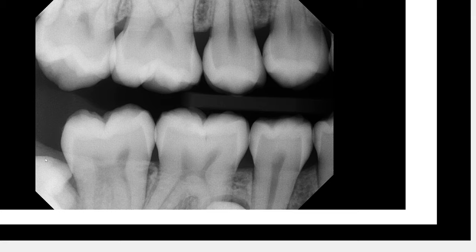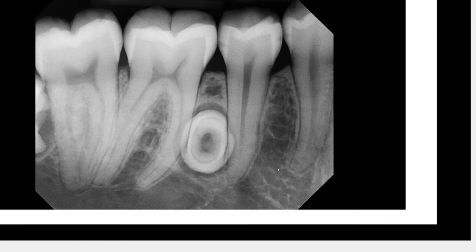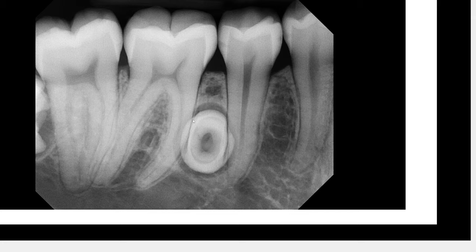Now let's take a look at the periapical radiograph of this area. Here we have the full visualization and full extent of this lesion — a very well-defined radiopaque opacity with a radiolucent rim surrounding it. It is partly superimposed with the roots of number 29 as well as number 30. Importantly, the PDL space is intact — that's a good feature to notice.